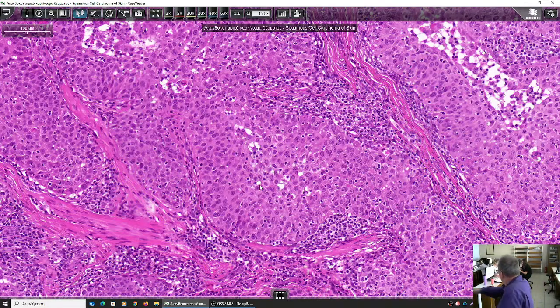That means if you see squamous cell carcinomas filled with keratin pearls appearing similar to what we saw in the seborrheic keratosis slide as pseudocysts. Remember that material that we saw in the seborrheic keratosis? If we saw that within the neoplastic population, we would say this is a well-differentiated squamous cell carcinoma because it keratinizes widely. Now, it's not the case here.